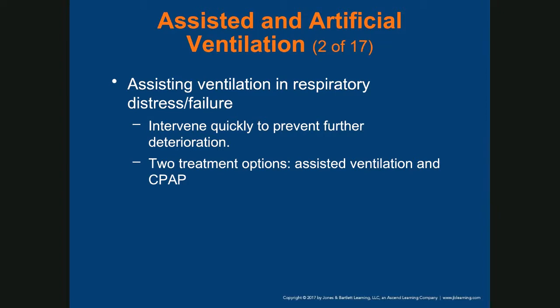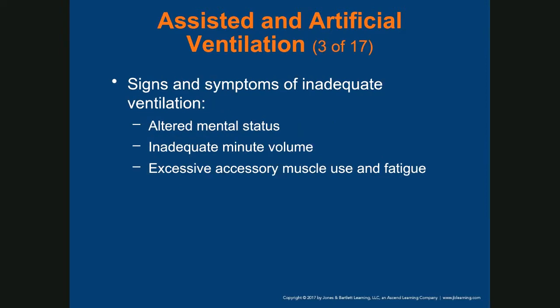So if they have fluid in the lungs, right, and the blood pressure is not low and they don't have any chest injuries, you can use a CPAP device.